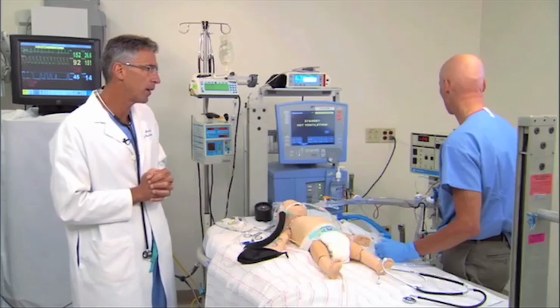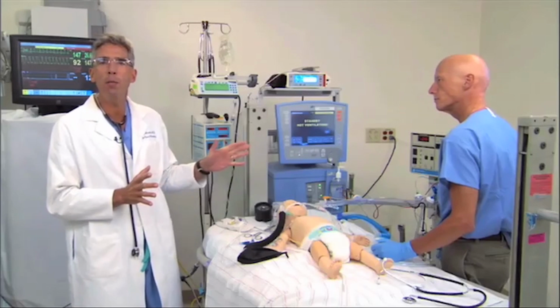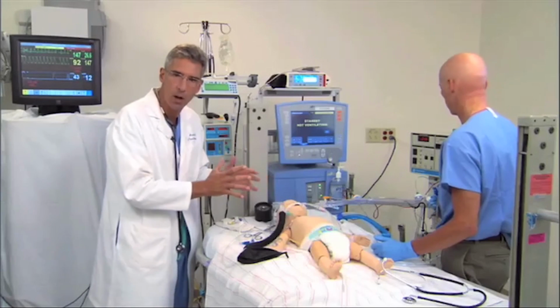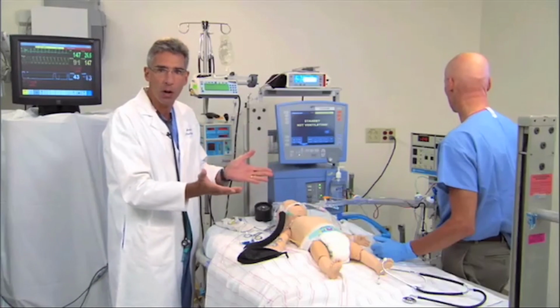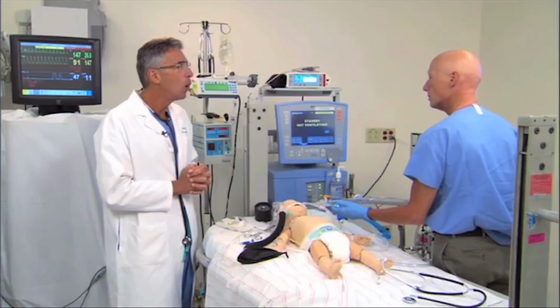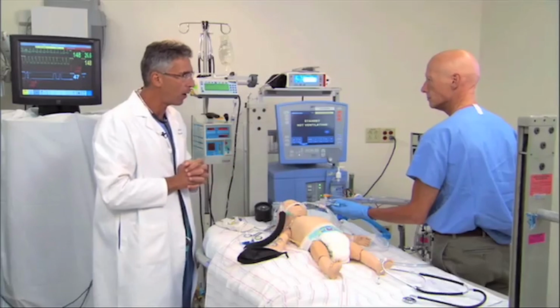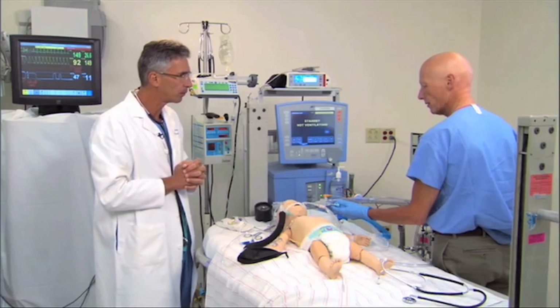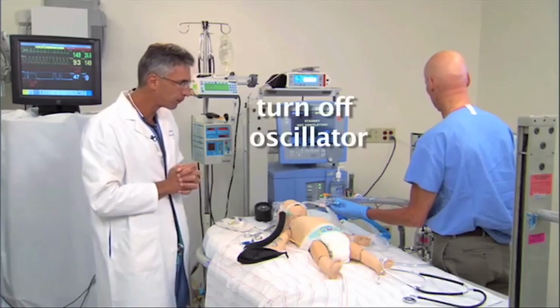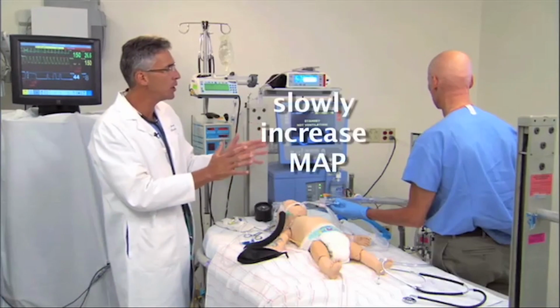Okay, where do you think we ought to target, Barry? I would do a recruitment maneuver and try maybe a 3 or 4 higher on the mean. Okay, so we're going to demonstrate now how we perform a recruitment maneuver on the oscillator. We're actually going to increase the mean airway pressure on the oscillator. Let's aim for a mean of 35, Barry. And we will then settle down on a mean airway pressure a little higher than we are now. How's that sound? I think that's fine. I'm going to shut the oscillator off while we do this. Oscillator's off. Now we're going to slowly increase the mean airway pressure.